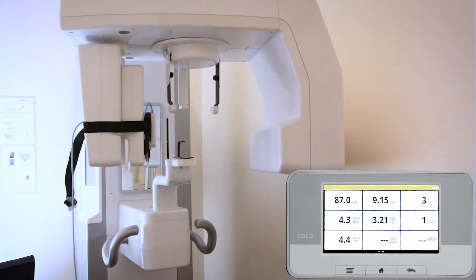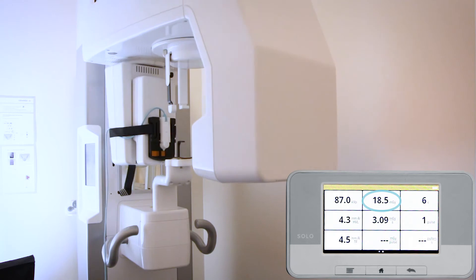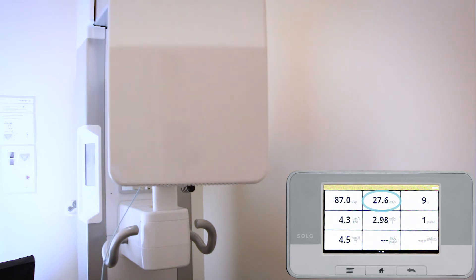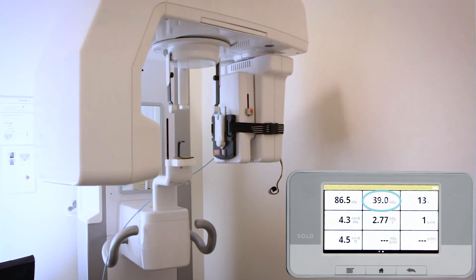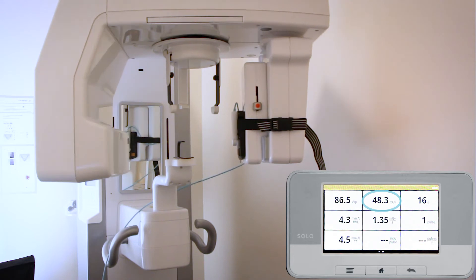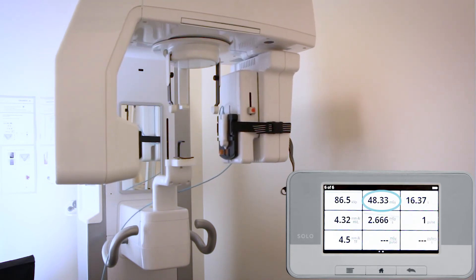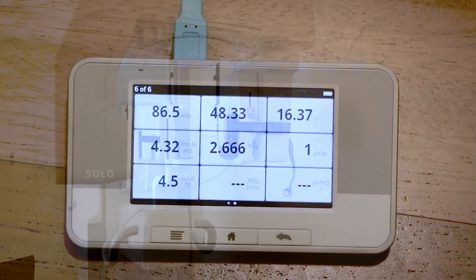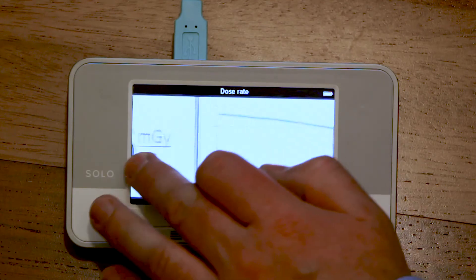The interesting parameter for confirmation of the position is the dose. The position of the highest dose is the correct position to start recording the other parameters as well. You find the dose parameter in the top center of the X2 screen.